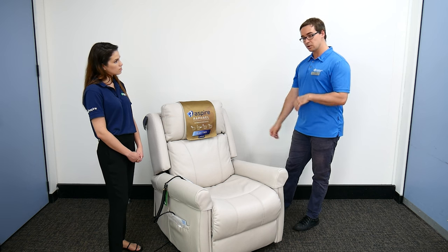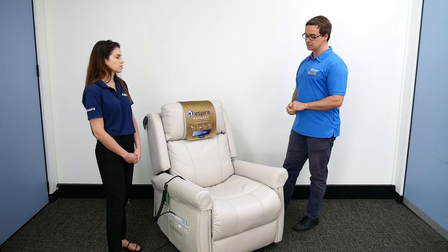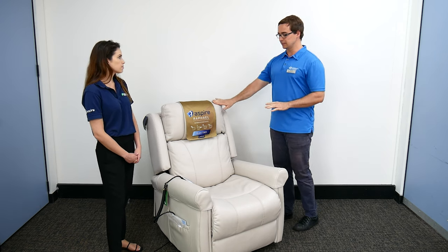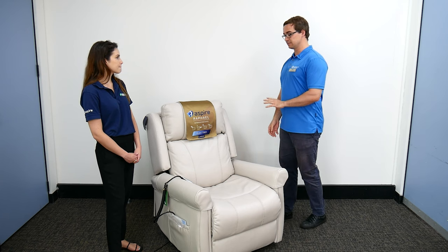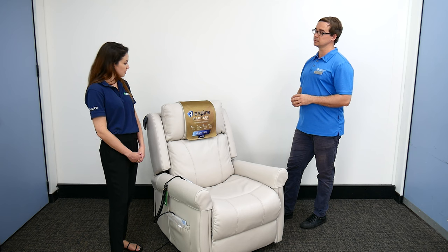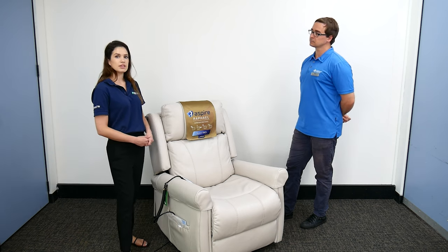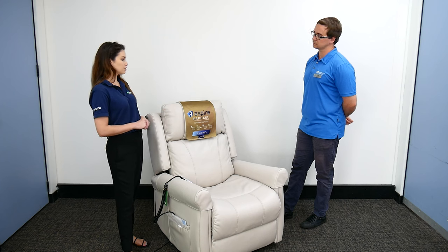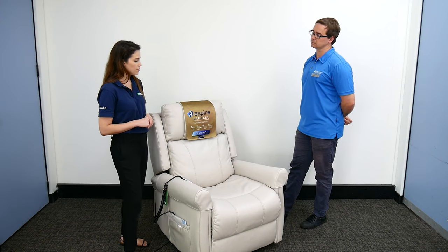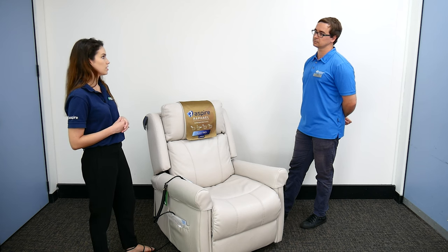Someone may also be living with continence concerns, which will impact the choice of fabric. We can have overlays and things as well. With the Raphael chair we do have custom fabric options — a whole range of choices — and we also have a universal chair cover that can be put over the top, which is definitely a consideration for someone with incontinence concerns.